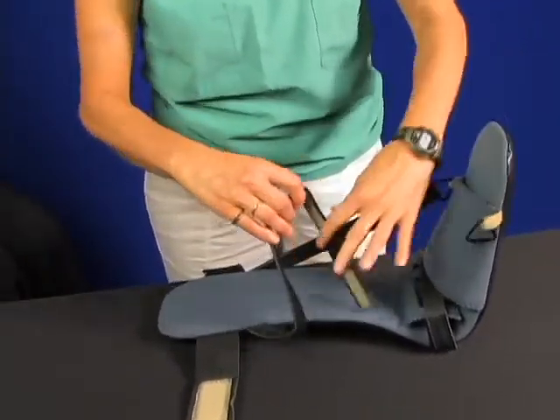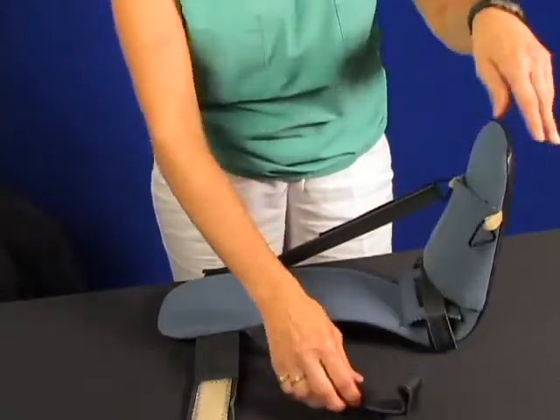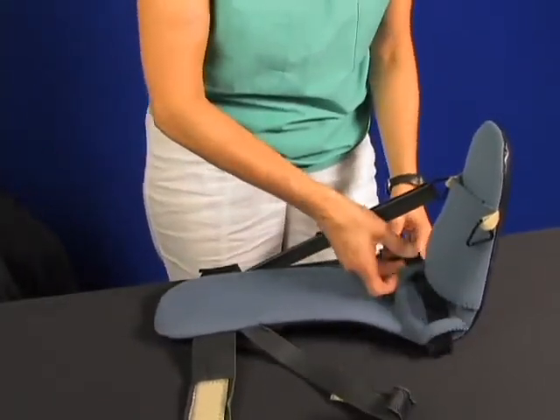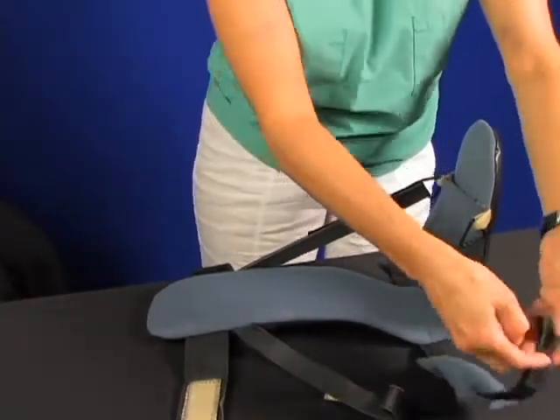Then release one of the side straps. Note the extra Velcro on the strap — this provides a greater range of adjustment. Now go to the instep and disconnect the instep strap. Open it up and swing the strap pad out to the side.